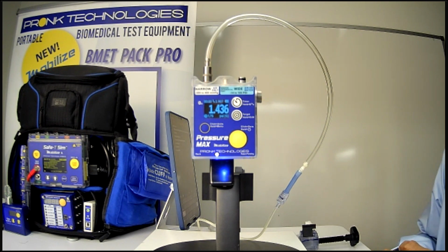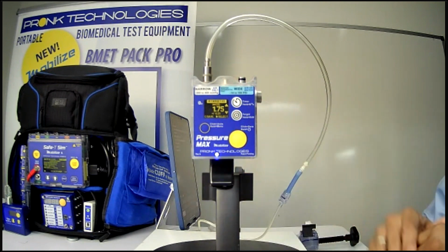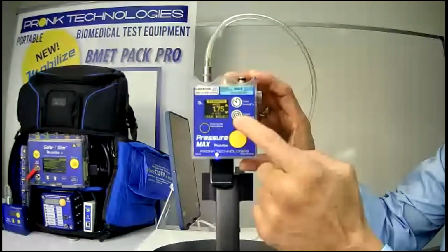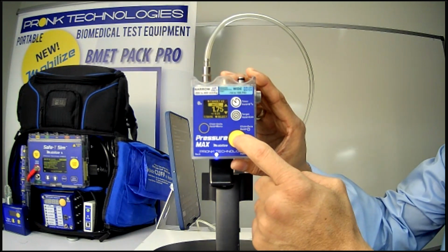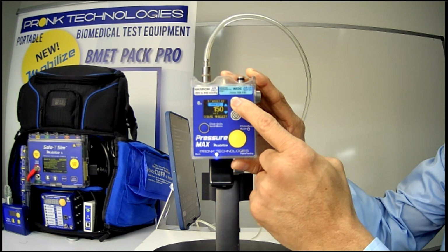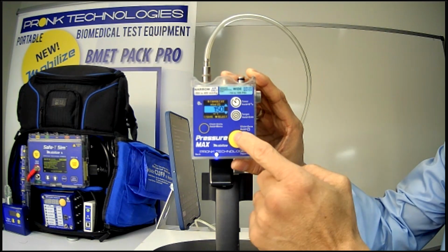And you can program these on the unit, which is really nice. So if I press and hold this button here, I can now go into my target menu and create and edit target pressures. So you can see here at the very top, I'm editing target number 2, and I can edit those values. I can just scroll down using the up and down arrow keys that correspond to the soft keys, which would be these keys here. I could change my unit of measure by highlighting it, and then up, down to change the unit of measure. So I could pick a different unit of measure if I wanted to. And then I could also confirm and program the actual target pressure.